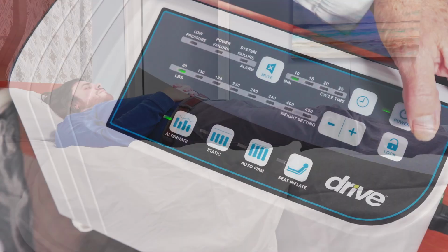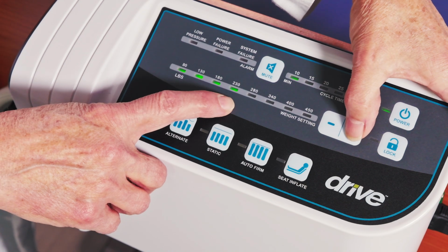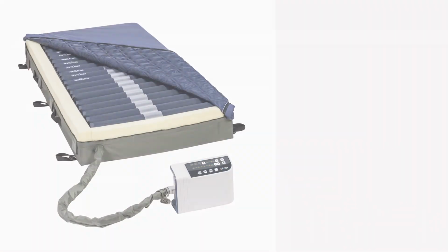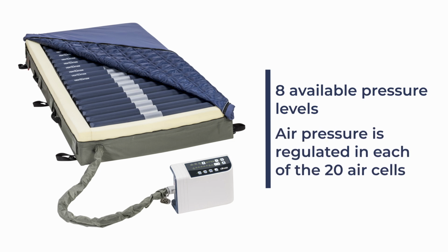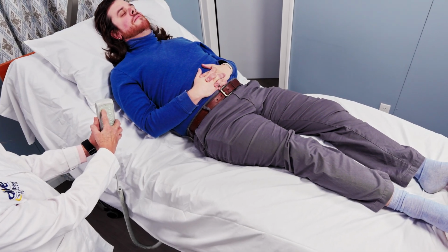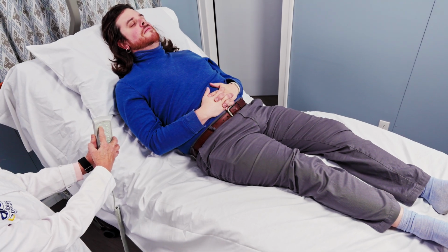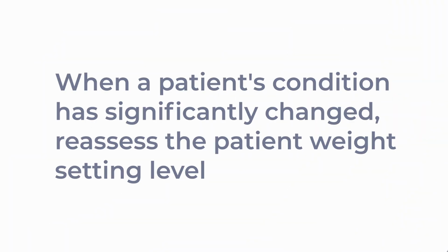adjusted anytime. As the weight setting increases, the pressure level indicator lights up green with each added level of pressure. There are 8 available pressure levels, and the air pressure is regulated within each of these 20 air cells to ensure pressure redistribution and therapy are provided. If a patient prefers a firmer or softer mattress, increasing or decreasing the setting to ensure proper pressure redistribution, patient support, and comfort is correct practice. When a patient's condition has significantly changed, reassess the patient weight setting level.